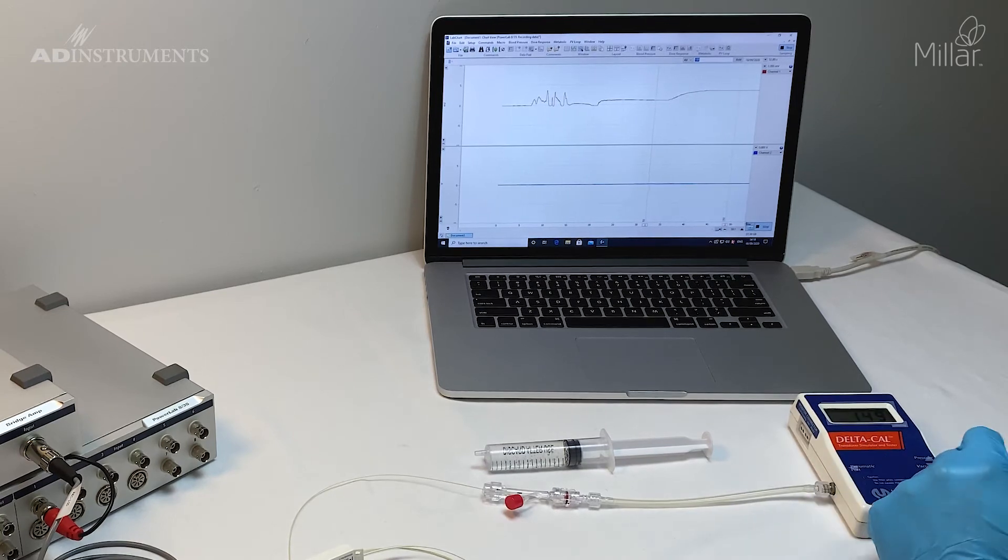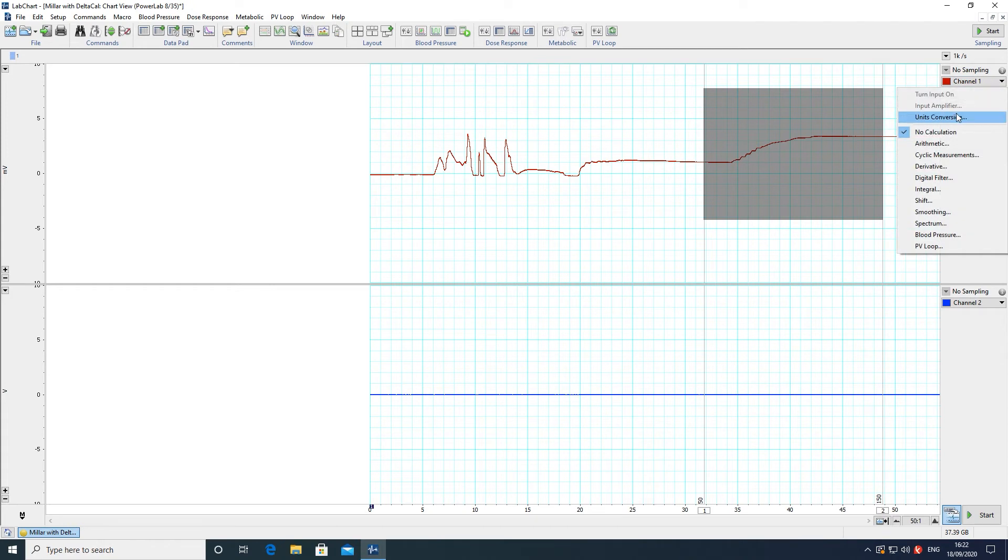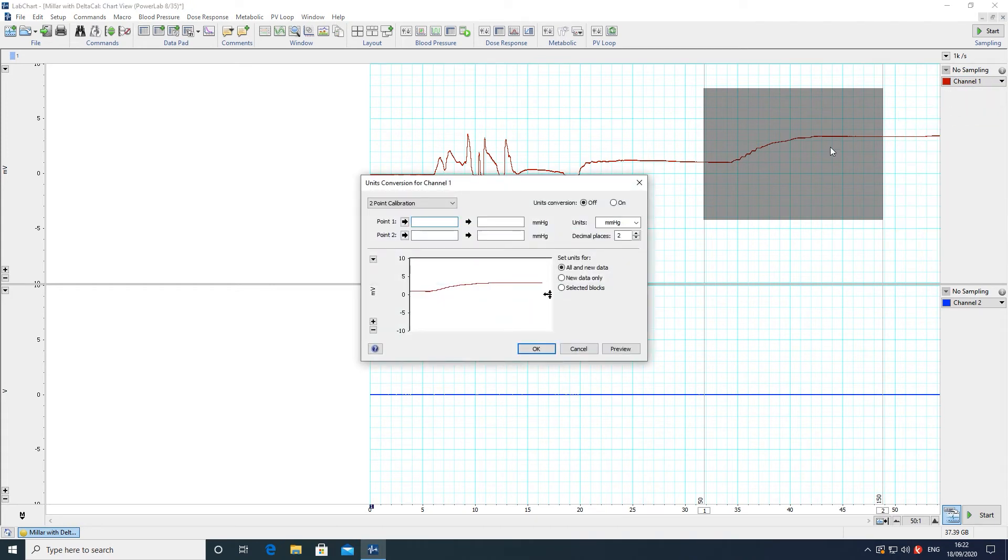Once done, I can stop recording and calibrate for those two levels. I'll make a selection between the two comments, click on units conversion, and select the first part which was 50.